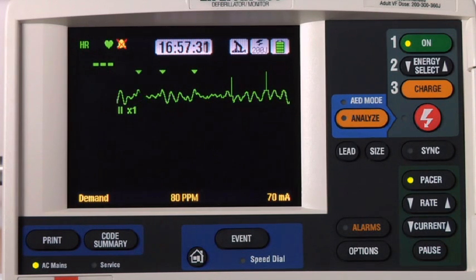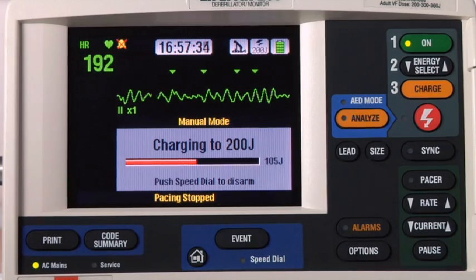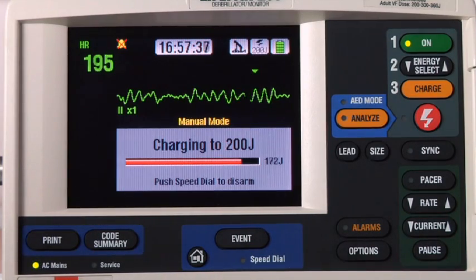If you're pacing and the patient needs to be defibrillated, press CHARGE — pacing stops automatically. Proceed with defibrillation as described in the manual defibrillation section. And that's it for pacing. Thank you.